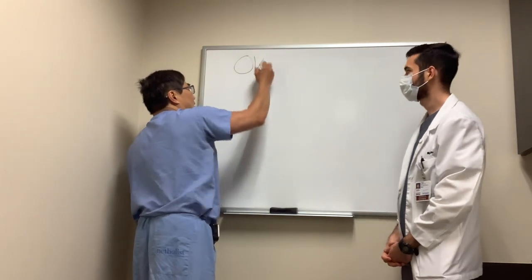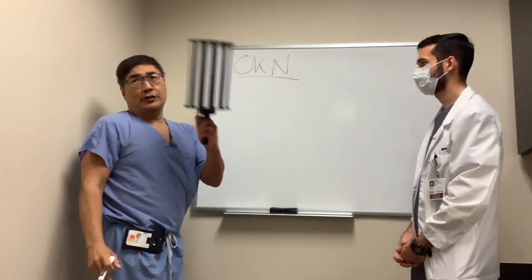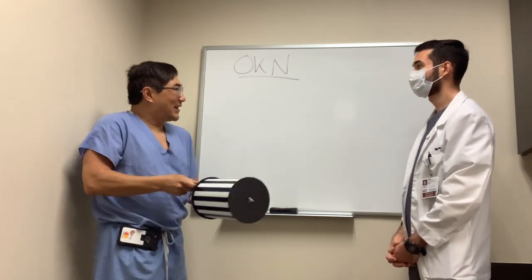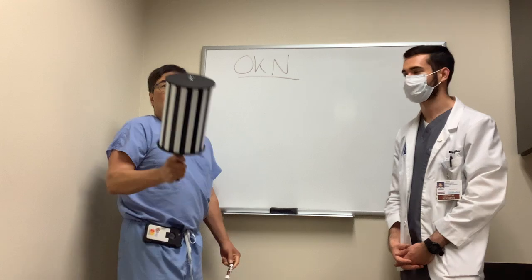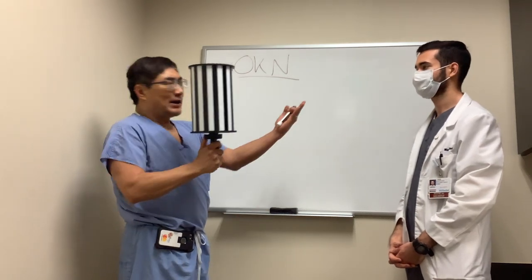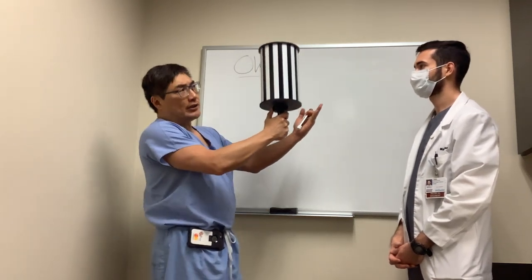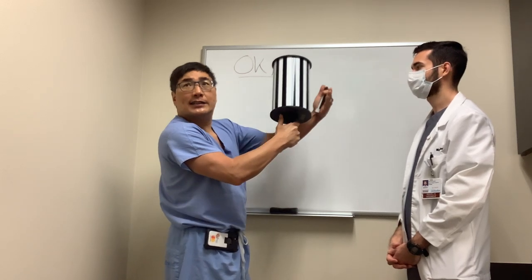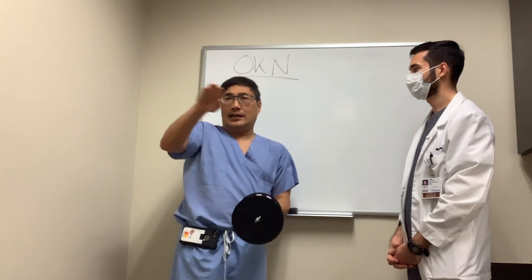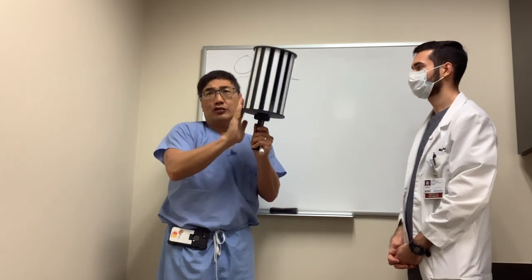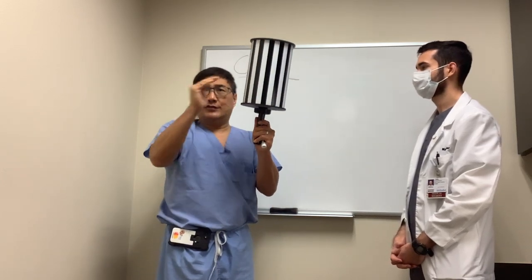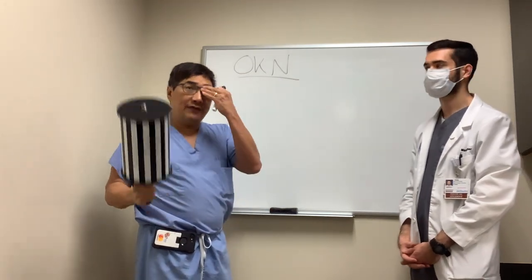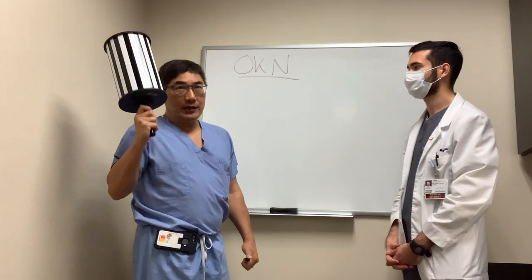Someone wanted to know about this instrument called an optokinetic nystagmus drum, and today I'm joined by Matthew Miller who's going to help us demonstrate. The way to use this drum is: as I rotate it, Matthew's eyes are going to follow the target and then saccade back, generating this pursuit-then-saccade movement as he follows the stripes. It can be used for both afferent checking of vision and efferent checking of eye movement.